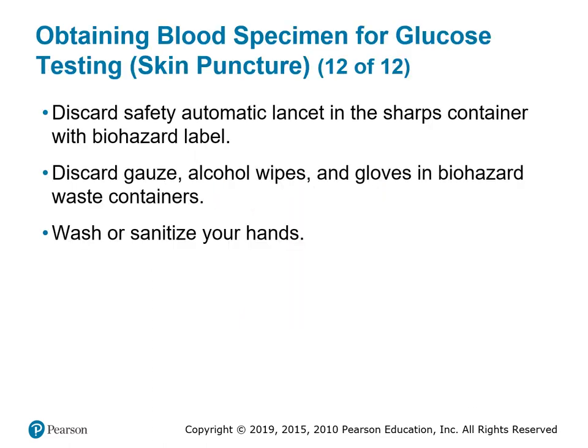Discard the safety automatic lancet in the sharps container with the biohazard label. Discard gauze, alcohol wipes, and gloves in the biohazard waste container. Wash or sanitize your hands.